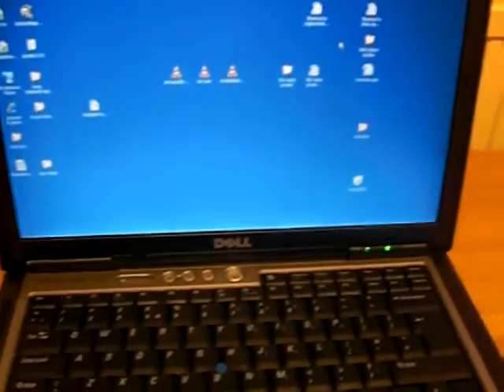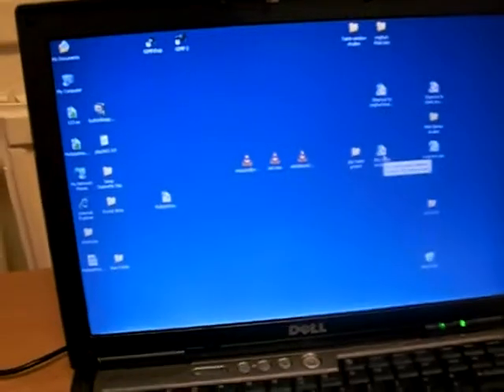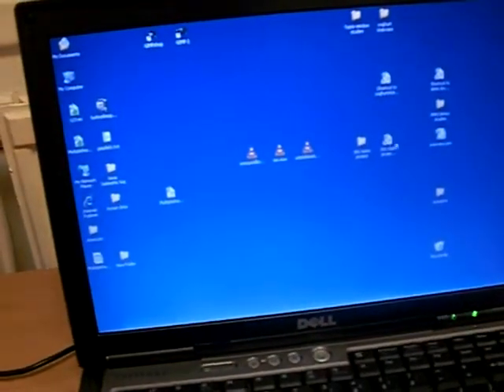Let's talk about what you do when you get a participant in here. The first thing you do, after giving them the instruction sheets, etc., all that fun stuff, you need to click on BSc Taste Project, and we're loaded, and we're presented with this screen here again.